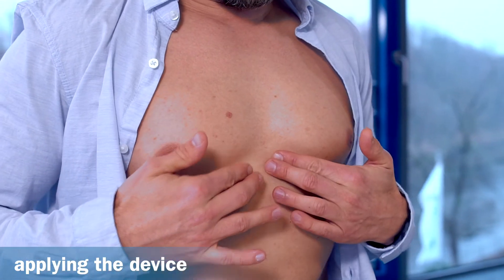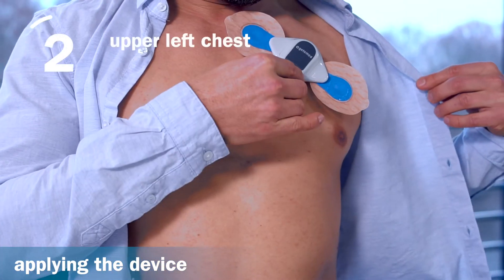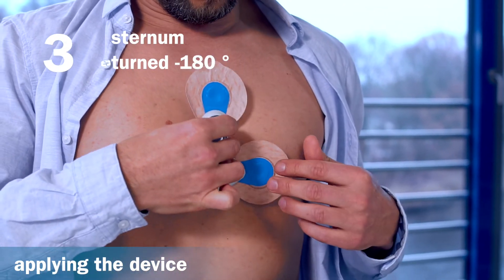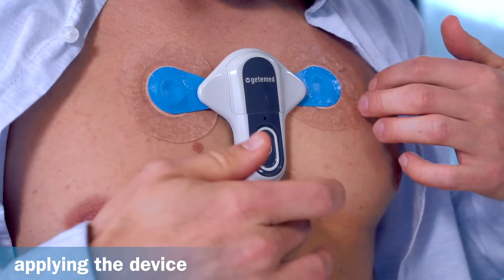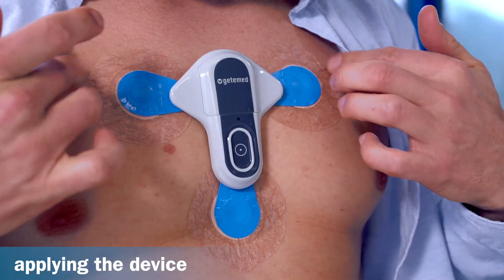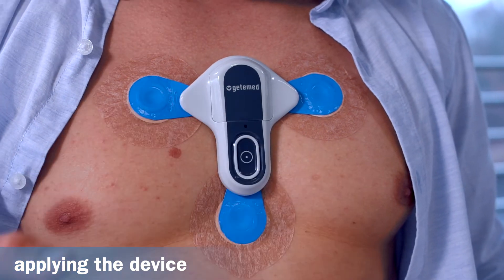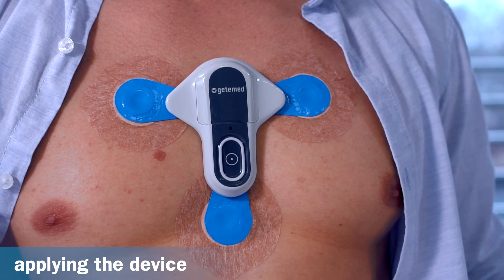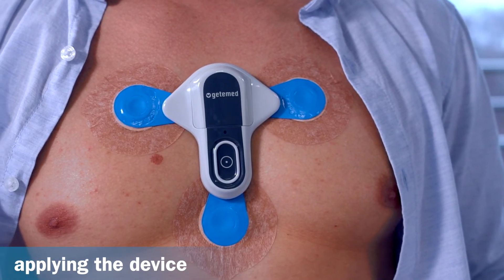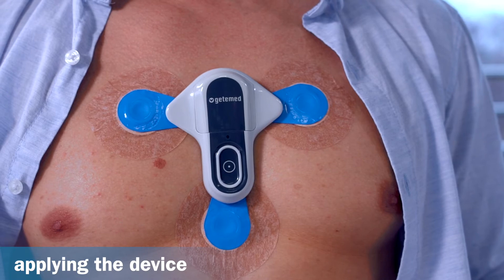The recorder can be worn in three ways: one, on the sternum; two, on the upper left chest; or three, turned 180 degrees on the sternum. Once you have made your decision, gently press the recorder with the electrodes attached onto the chest, and press down the edges of the electrodes to make sure they are firmly attached. Next, start the recorder by firmly pressing the button. A beep sounds and the light indicator cycles through all its colours. Once the heart rhythm is detected, the light indicator flashes green every five seconds — the recorder is now ready for use.